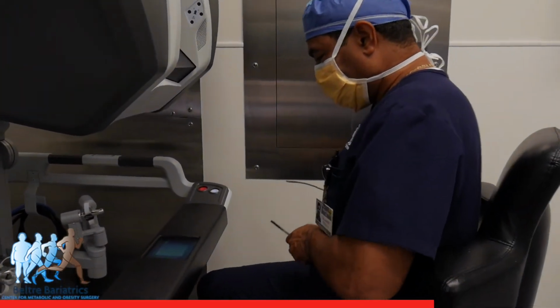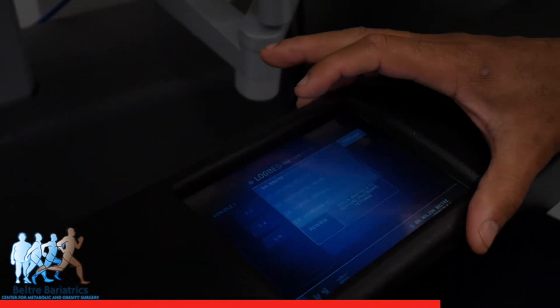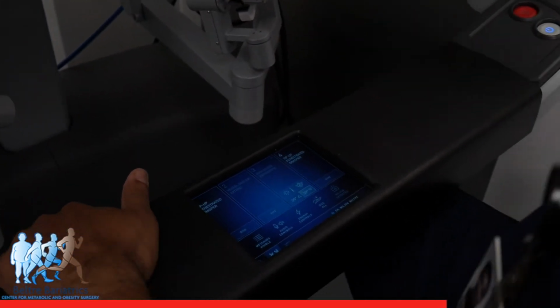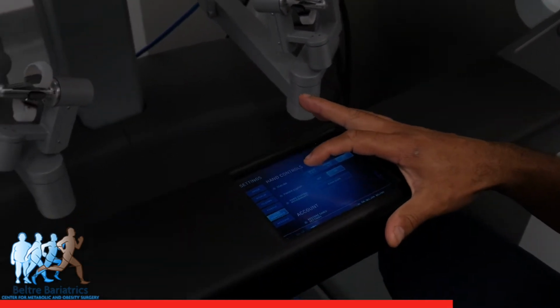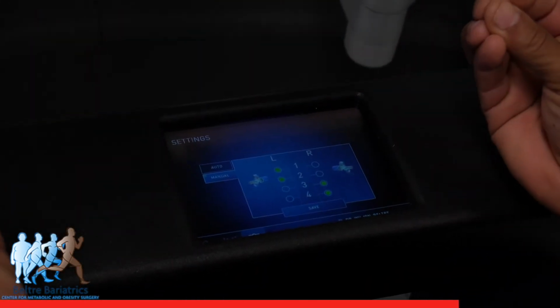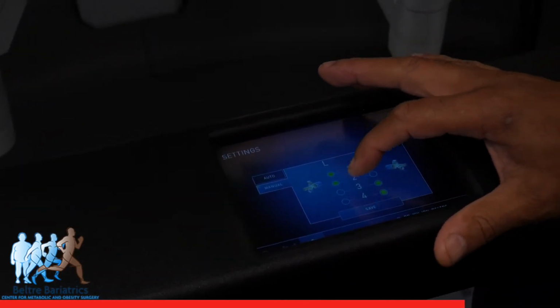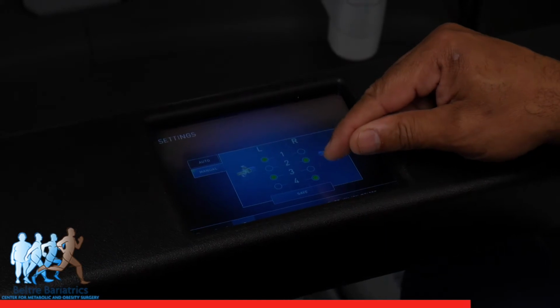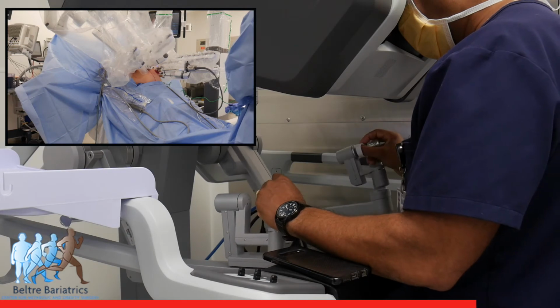So, if you look over here, you can see my name. Aquí ven Dr. Beltré. Le doy aquí. And this will go back to my previous settings. Then I assign controls to the robot. Entonces le digo al robot cómo yo quiero controlar los brazos del robot. Con mi mano derecha voy a controlar 2 and 4. With my right hand I'm going to control 2 and 4, and then with my left it's 1 and 3. I am pretty much controlling each movement of the robot.